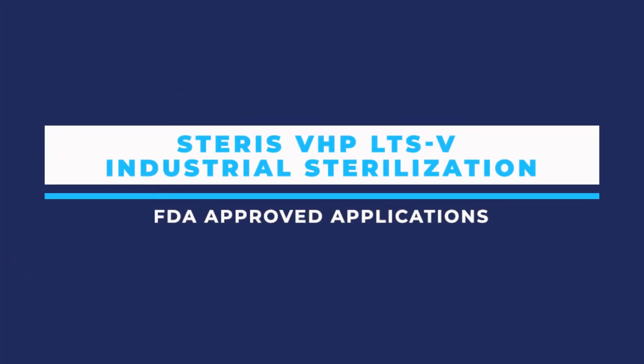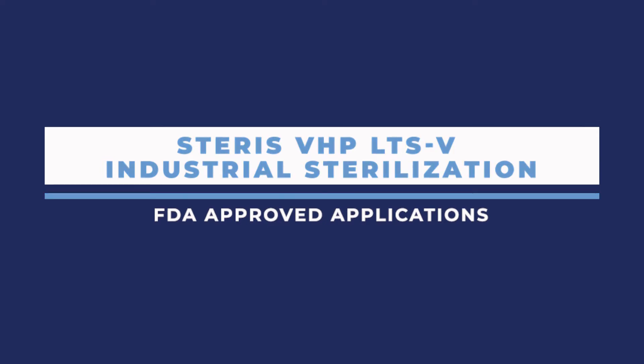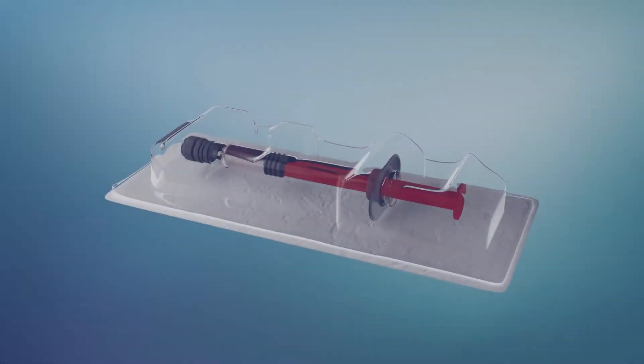VHP sterilization technology for low-temperature terminal sterilization is ideal for applications that have material, residue, or temperature sensitivities.